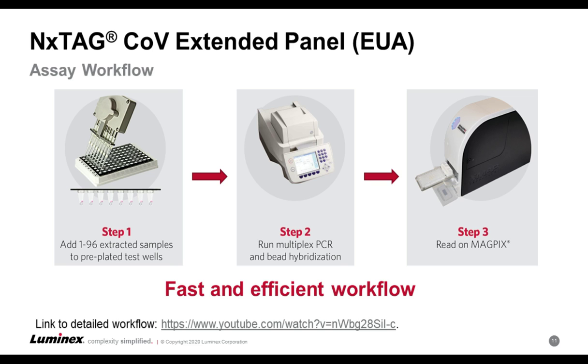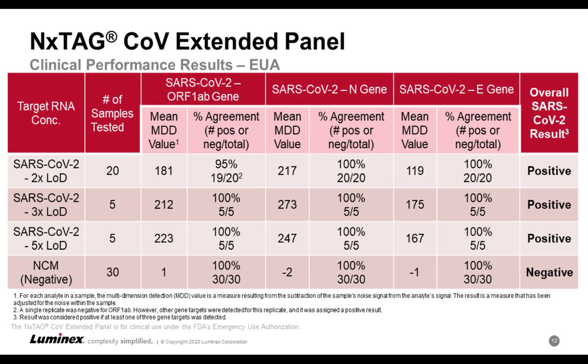This is then placed on a thermocycler, where it cycles for approximately 2.5 hours, and then finally analyzed on the MagPix. The MagPix read takes about 30 to 45 minutes for a full plate.